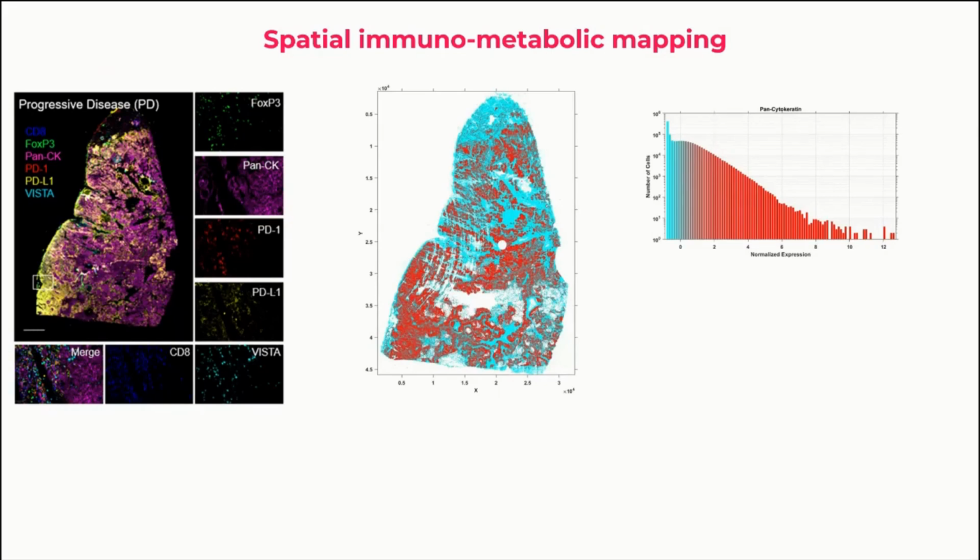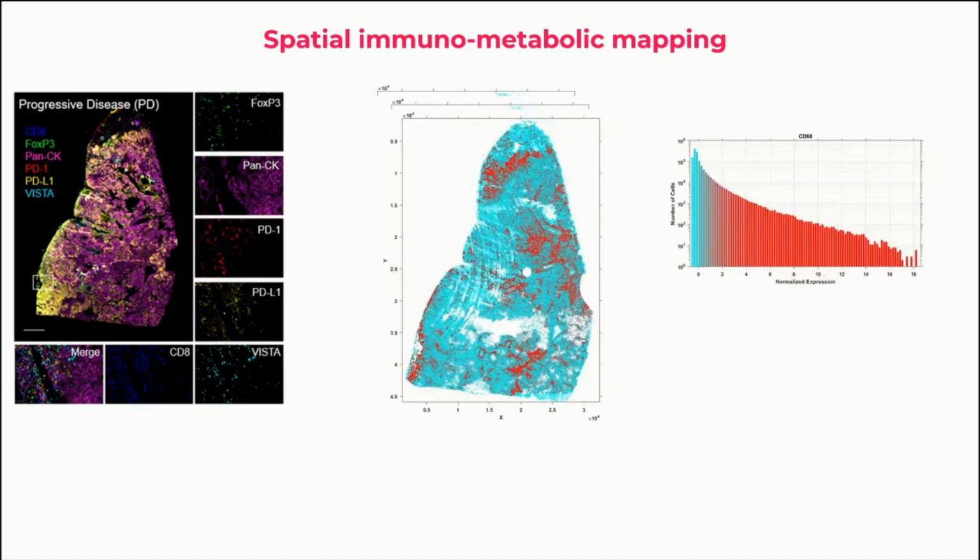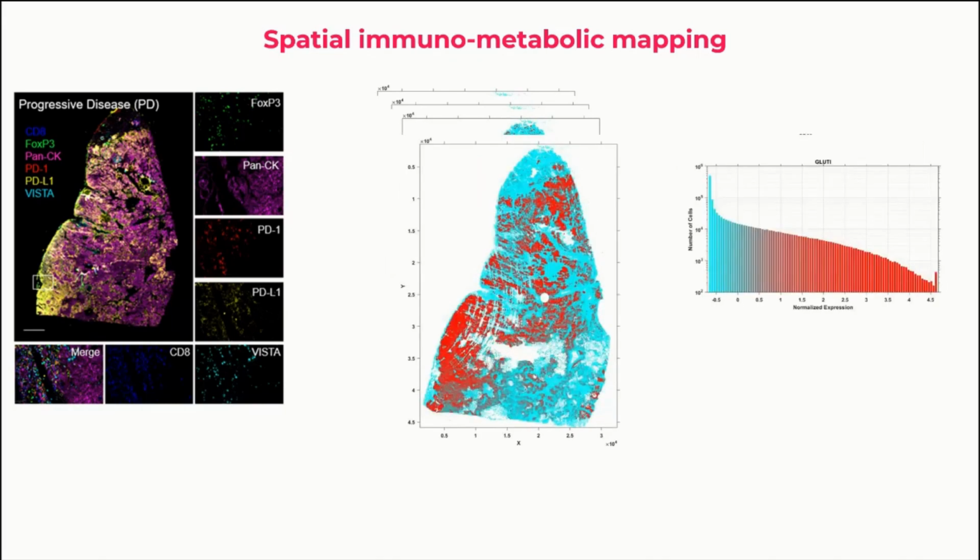So the red is high, blue is low. So this is looking at the tumor in the tissue. And I'll just now start to pan through the individual channels for each of these. And so when we look at CD8, the CD8s are on the periphery. They're not entering the tumor. CD68, same, it's overlapping with where the CD8 cells are. It's not really infiltrating the tumor.